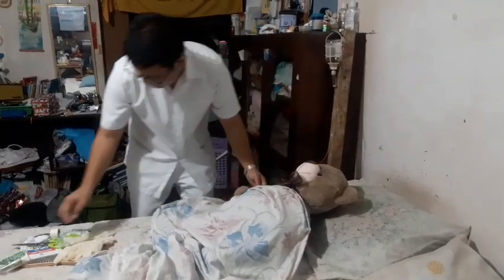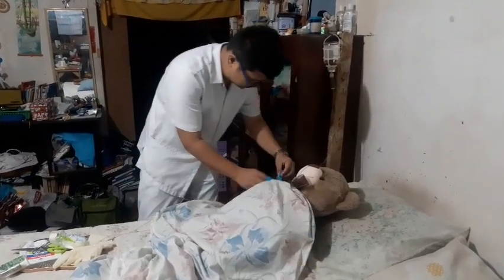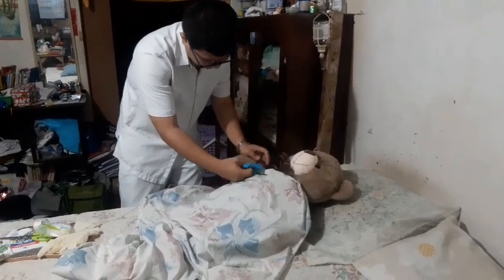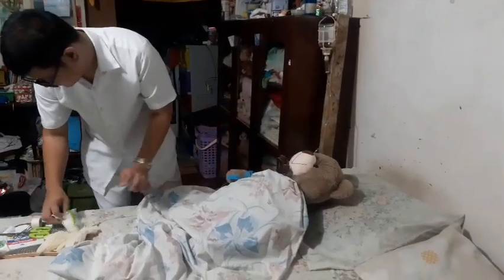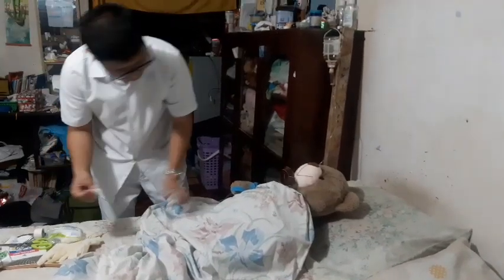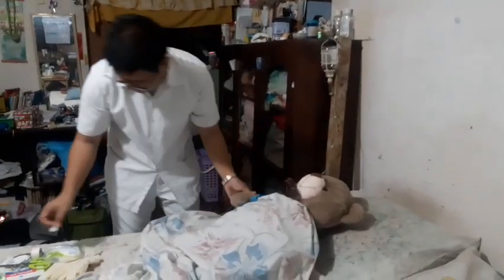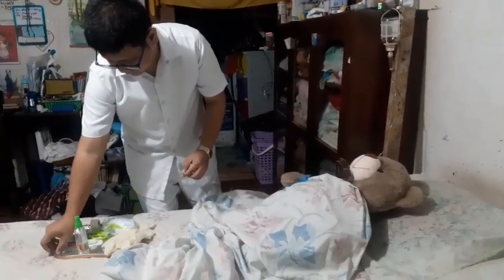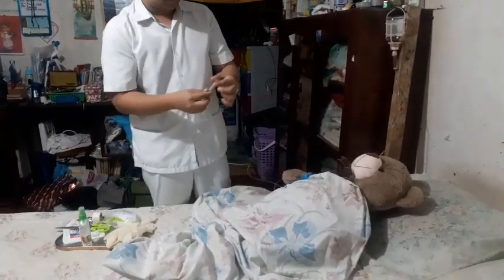And then gloving and site preparation. Gloves must be worn. Clean the site with a cotton ball wet with alcohol, using a circular motion, working from the center outward, and allow it to air dry. Another step is cannulation. In cannulation, use the non-dominant hand to pull the skin taut below the entry of the site.